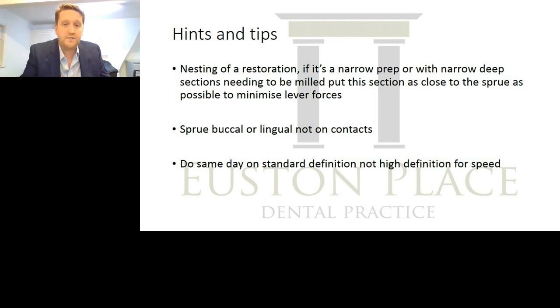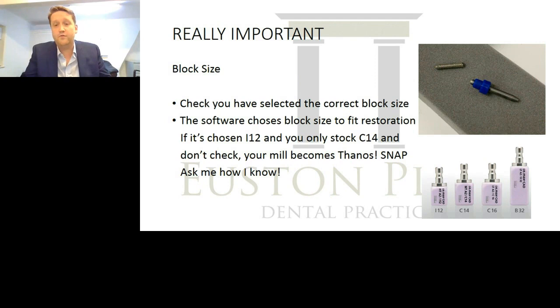Block size, this is the harsh lesson I've learned. You need to check you've selected the correct block size. The software automatically chooses a block that will fit the restoration in it. If it's chosen a smaller block and you have put a bigger block in, then it will snap your burr. So you need to make sure you get the right size of block. Now, you're not necessarily going to stock every block in every color. So again, this is important to plan beforehand.